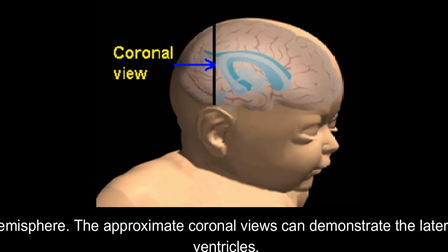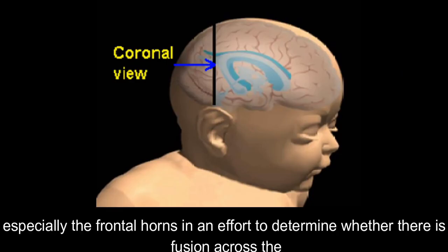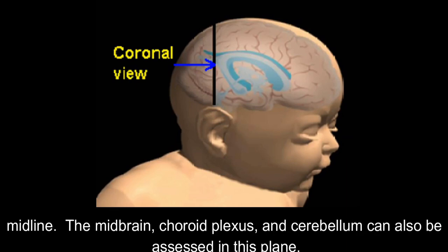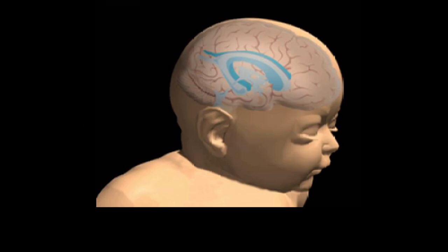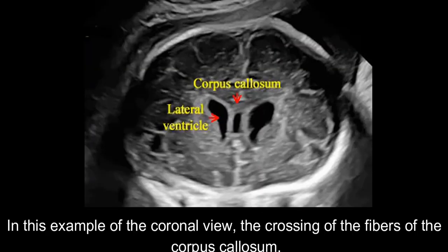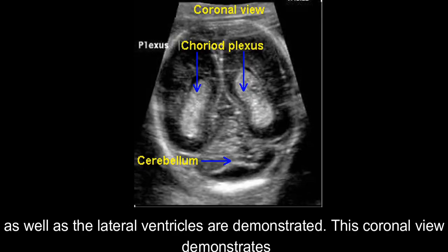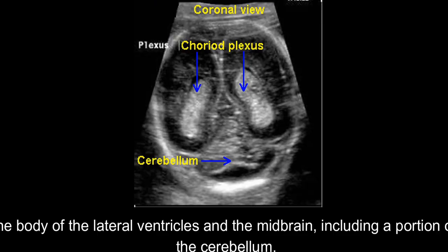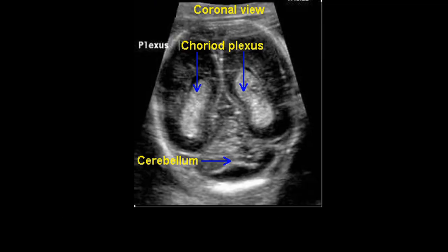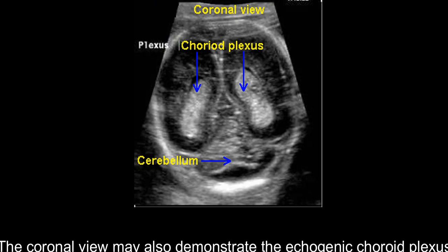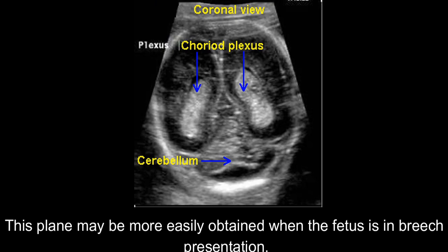The approximate coronal views can demonstrate the lateral ventricles, especially the frontal horns in an effort to determine whether there is fusion across the midline. The midbrain, choroid plexus, and cerebellum can also be assessed in this plane. In this example of the coronal view, the crossing of the fibers of the corpus callosum as well as the lateral ventricles are demonstrated. This coronal view demonstrates the body of the lateral ventricles and the midbrain, including a portion of the cerebellum. The coronal view may also demonstrate the echogenic choroid plexus. This plane may be more easily obtained when the fetus is in breech presentation.